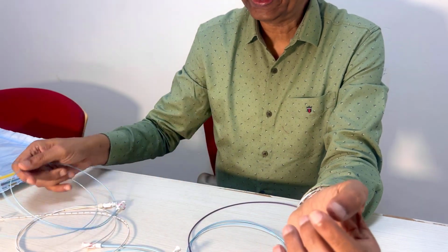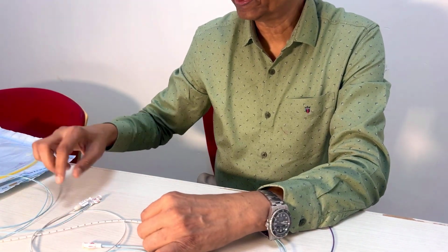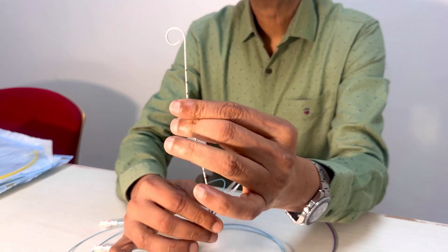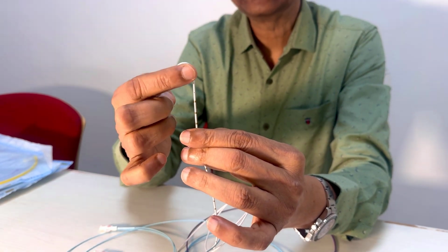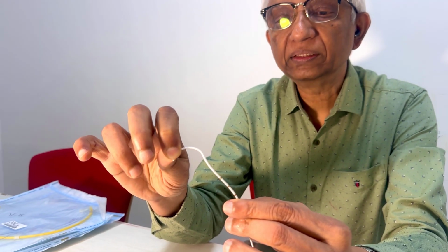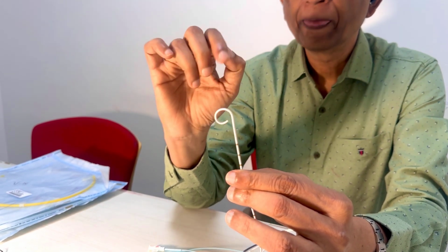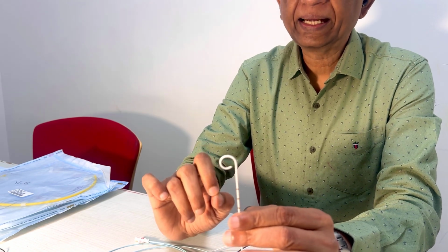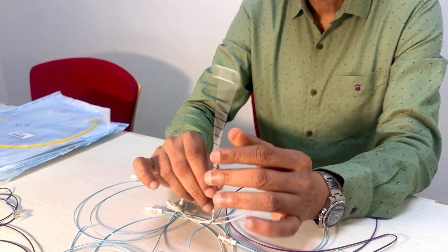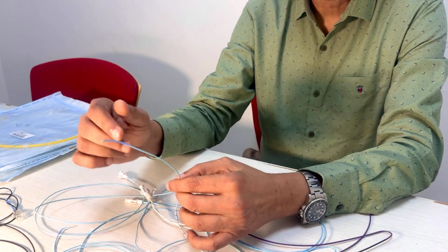For example, typically a pigtail catheter is a catheter that will have multiple side holes. See, for example, this is a pigtail catheter. If you look at this catheter very carefully, you'll see there are holes on the side here, and there is a tip hole. So even if you can get this tip into a selective vessel, you still don't inject because of the danger of particles escaping out. Have we got this? Also, you don't use these kinds of catheters for pushing out coils. Sometimes some part of the fibers will get knotted inside it, right? So this is another concept: catheters can have a single tip hole or multiple holes.